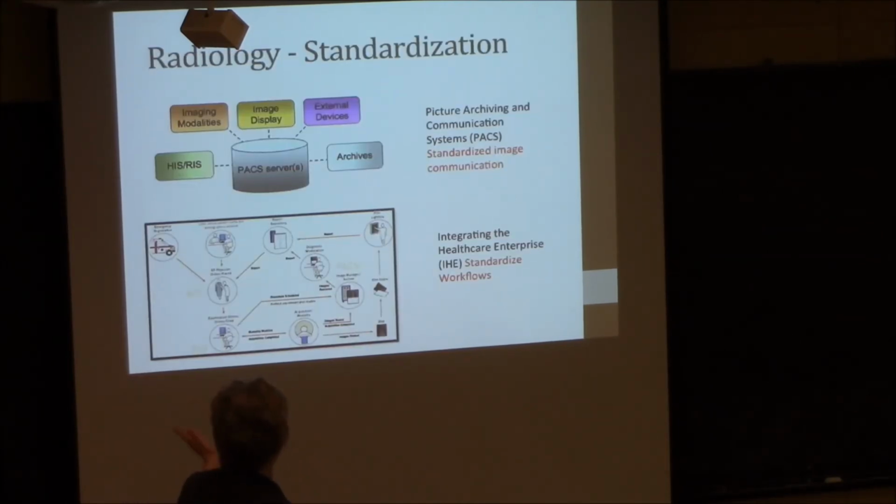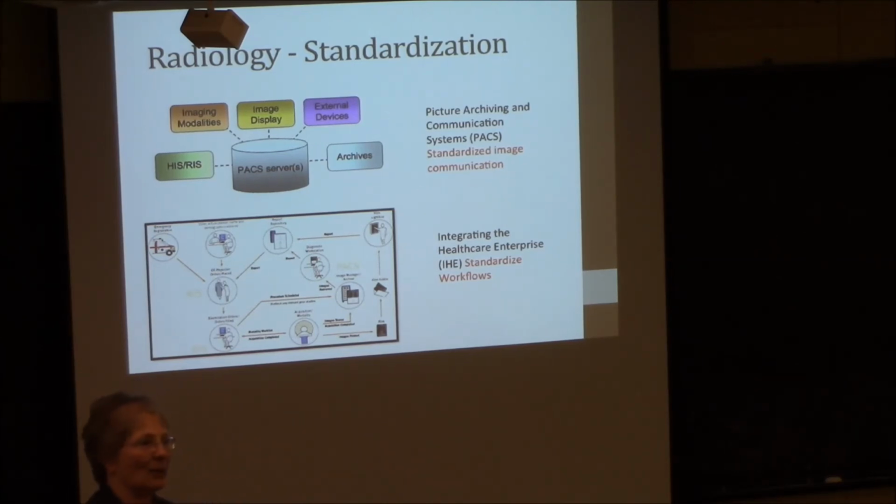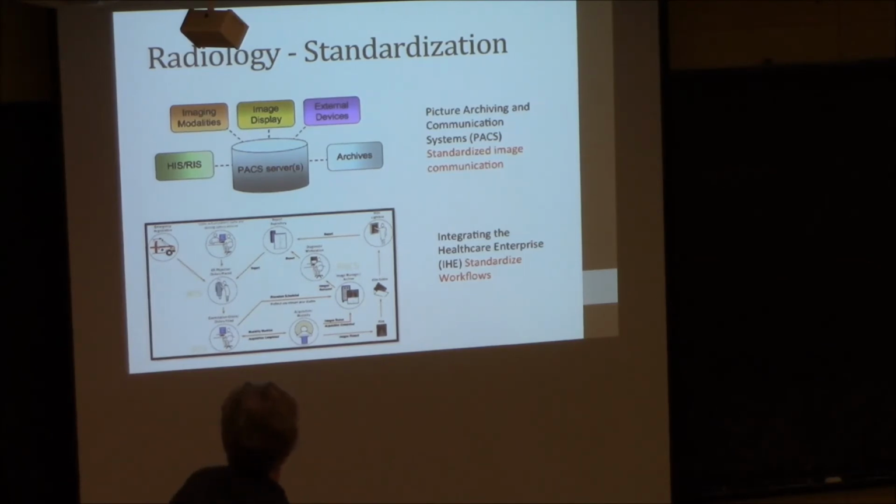And then standardization. There's lots of ways of standardizing data. That's our big problem right now, is how we're going to standardize the data. We have DICOM, you've probably heard about it. That's how we share images. DICOM is a special format and a special sharing technique for imaging in medicine. If you don't have a DICOM reader, you can't read DICOM images. Photoshop has one plug-in now, so does OsiriX, or most any of the freeware ones.